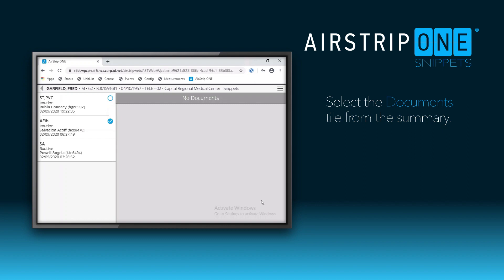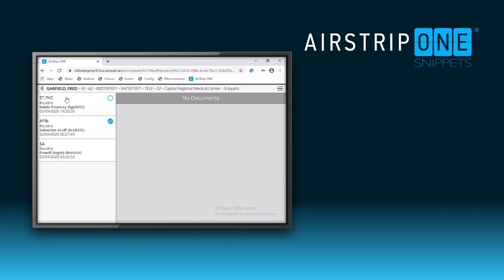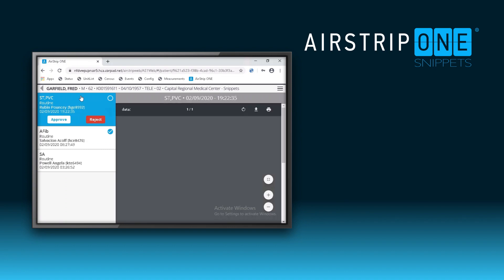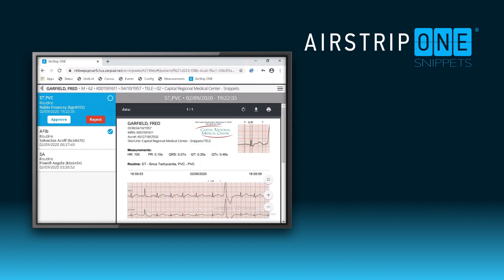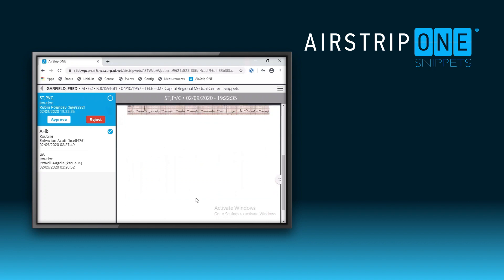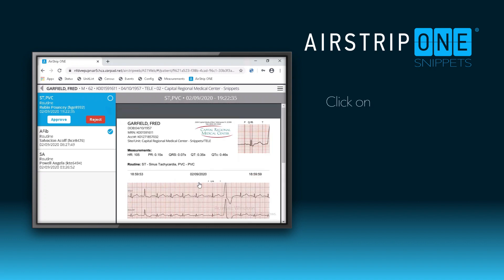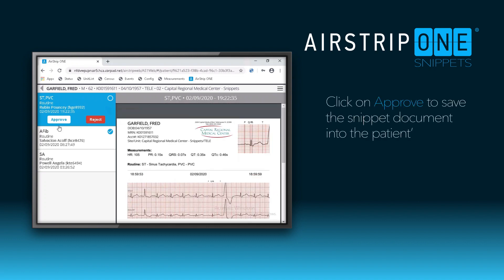Again, the open circle lets me know that there is a document that needs to be approved. I can see that there are PVCs, and if I agree with all the measurements, I would click Approve and that document would now be in the patient's EMR.